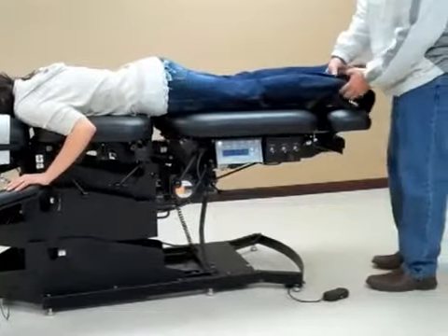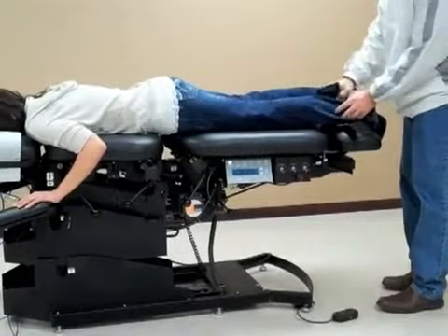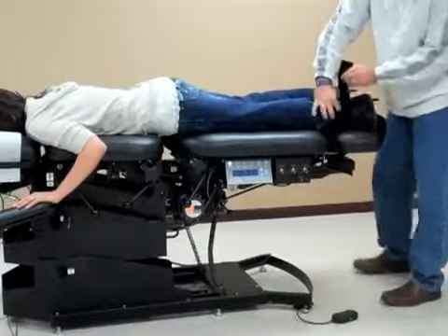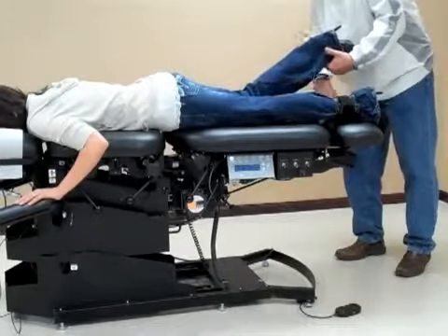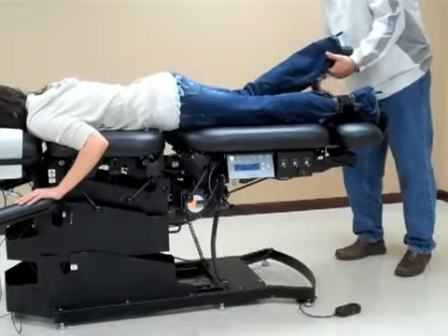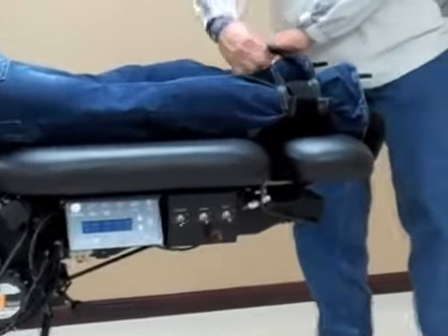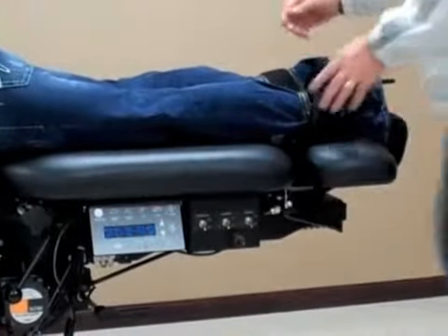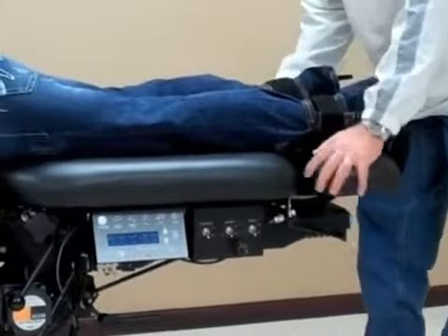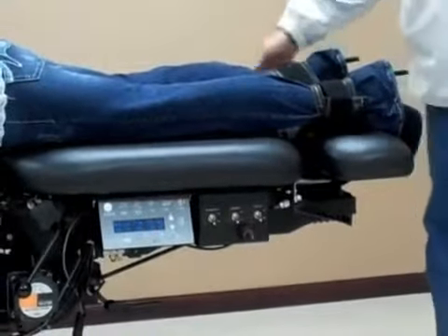Next, we'll use the ankle straps with the Velcro — just undo it and bring it around. Once we have the ankle straps secured, we can also elongate the table by stretching it just a little bit to make sure the table is tight.